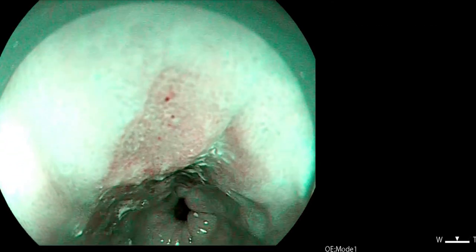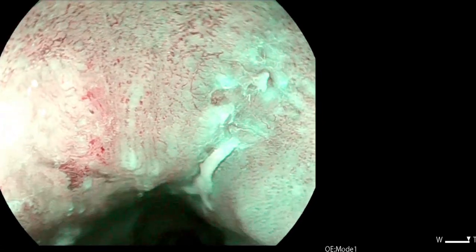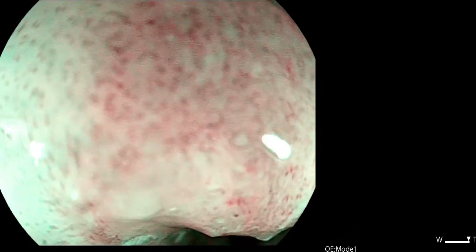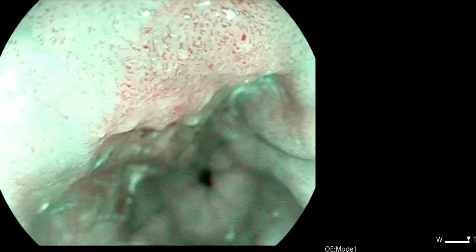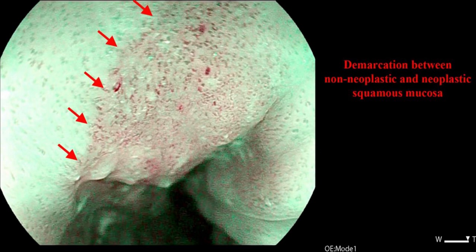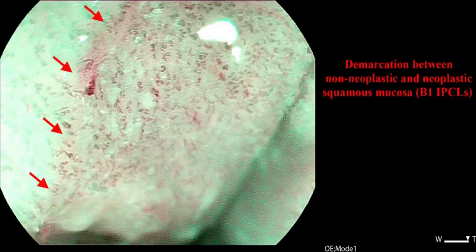We then shift our attention to the lesion. With magnification, we can see that the IPCLs have become somewhat more irregular with a larger structure and variable calibre. However, the loop structure is still maintained. This is indicative of M1-M2 carcinoma.